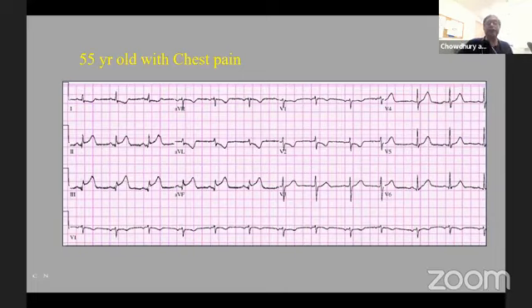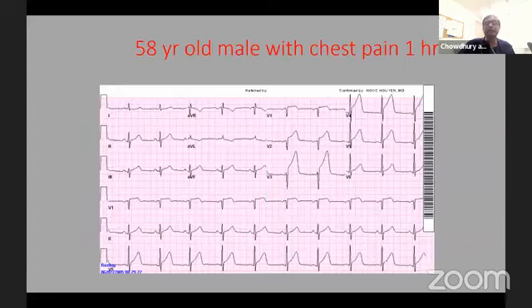Once we sort that out and there are no complications, you can then convince yourself that the chest pain is typical of MI. The EKG looks like MI. You can give lytics and a pharmacoinvasive strategy, or go to the cath lab. Similar thing, the patient has typical chest pain, typical EKG, life is easy: give lytics and a pharmacoinvasive strategy, or go to the cath lab and load the patients with full pharmacotherapy.